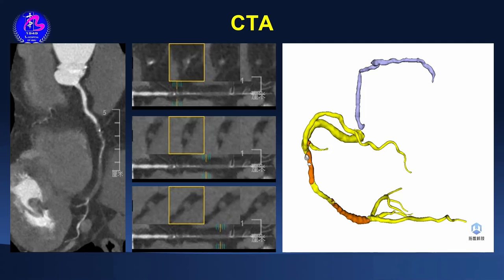For this patient, certainly there are several collateral channels from the RCA, the septal, the lateral collateral, the circumflex. Which one could be used for the retrograde approach PCI? We couldn't make sure. We should do a bilateral angiogram this time to choose the optimal collateral channel.